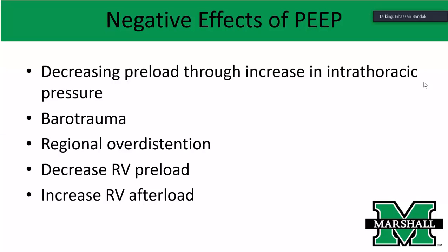So, of course, nothing is without negative effects. And what are the negative effects of PEEP? PEEP will decrease preload through increasing intrathoracic pressure. PEEP may cause barotrauma, and Dr. Haddadin said that he wants to titrate PEEP, but he also wants to look at the plateau pressure to make sure he's not causing damage to the lung, which is the right answer.